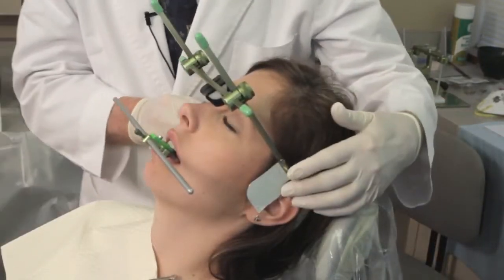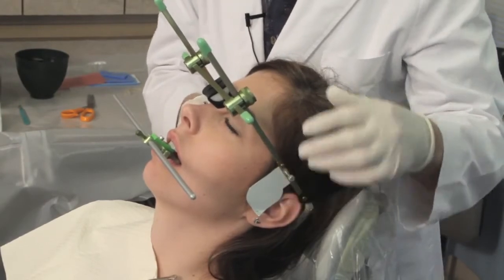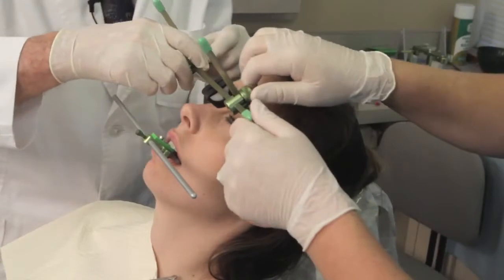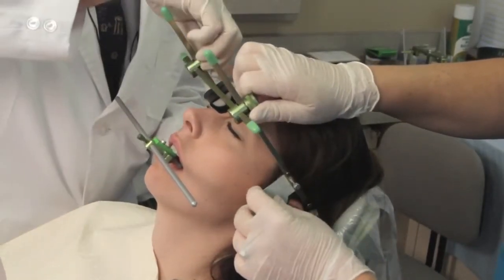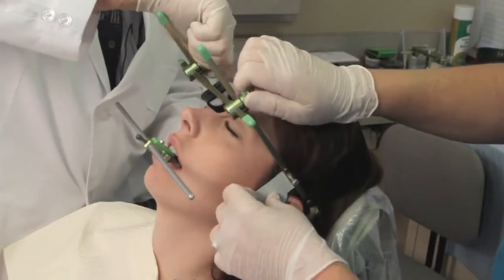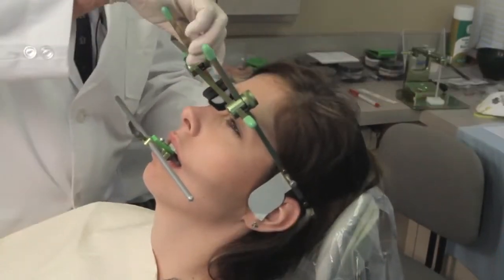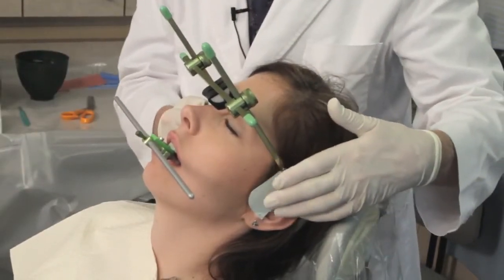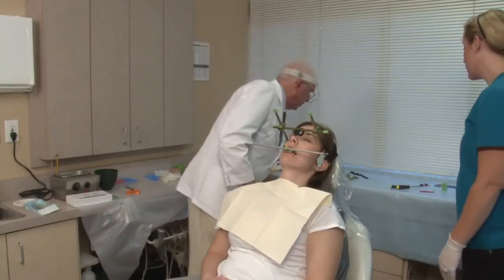Now then, let's make sure we're tight against the face, Christy. So loosen this and just push the flag into the face firmly. And then tighten again. Okay. You want the flag assembly against the face as tight as you can get it. Now we're ready to put the sidearms on.